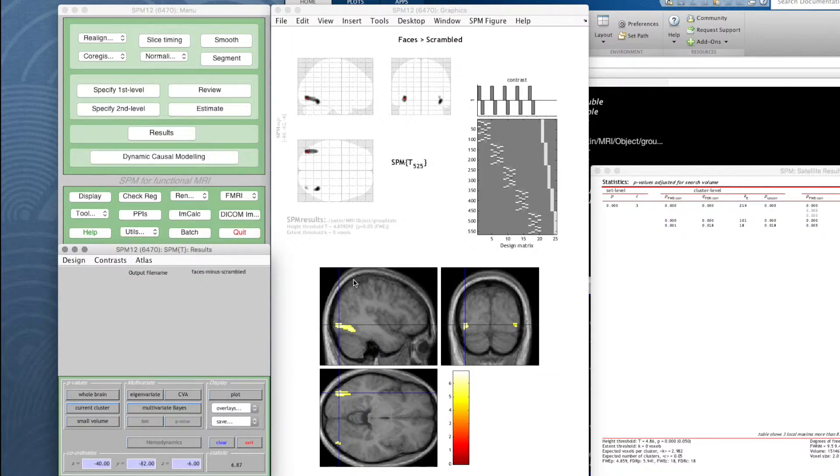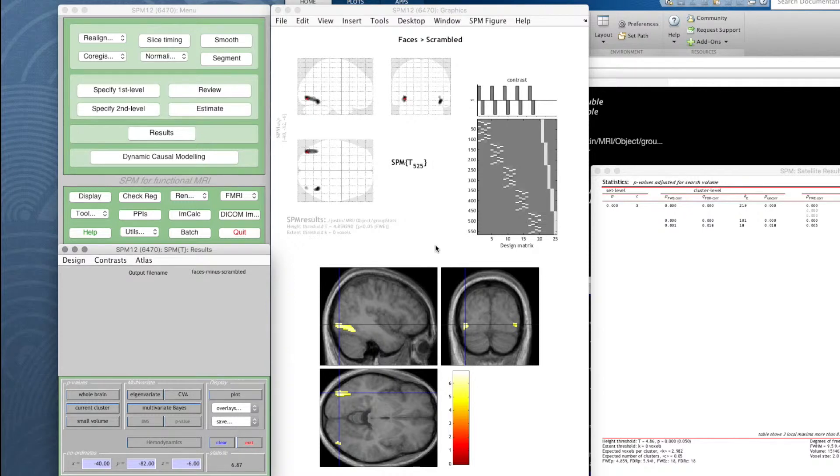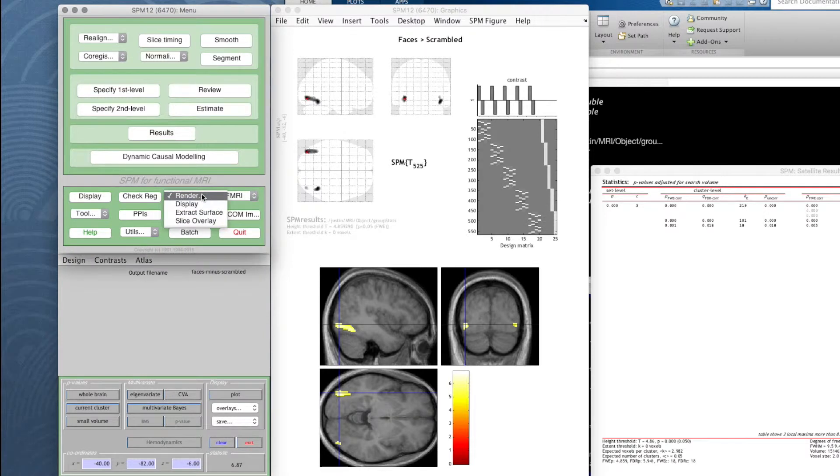That's saved that too. Now these blob sets are saved as images. We can visualize them in other programs if we want to, but we can go back to render, go to slice overlay.